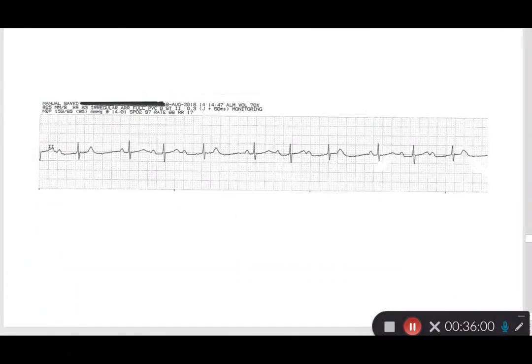All right, let's look at the next one. I can tell it's a heart block because my P waves and my PR intervals are way off, so I'm already kind of thinking heart block. I want to go through and start canceling out different heart blocks, and always start at the beginning. My rate is 66 beats per minute, so it's pretty good.